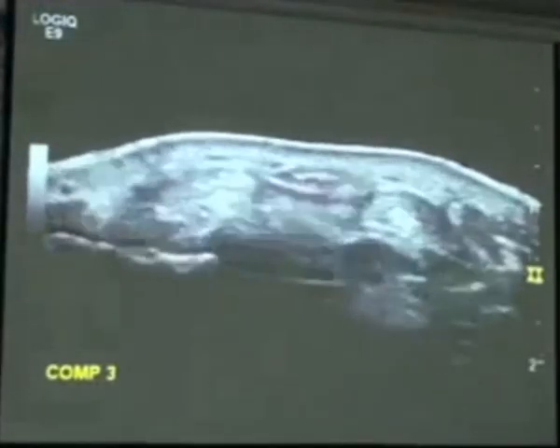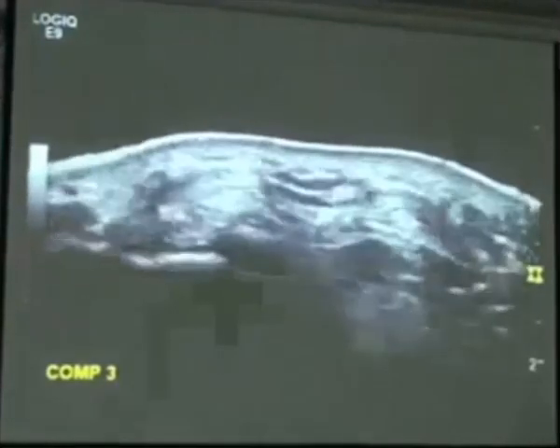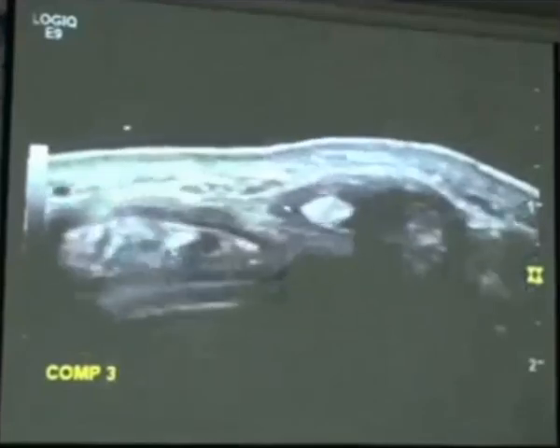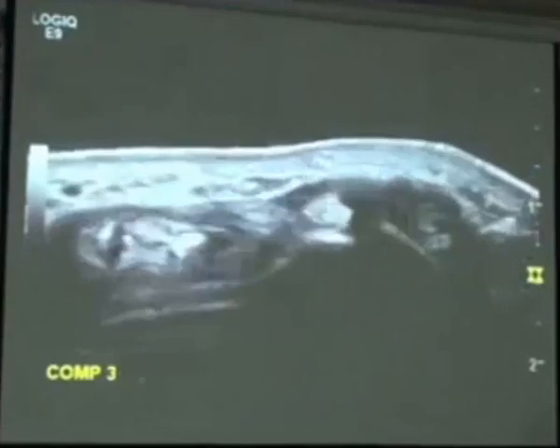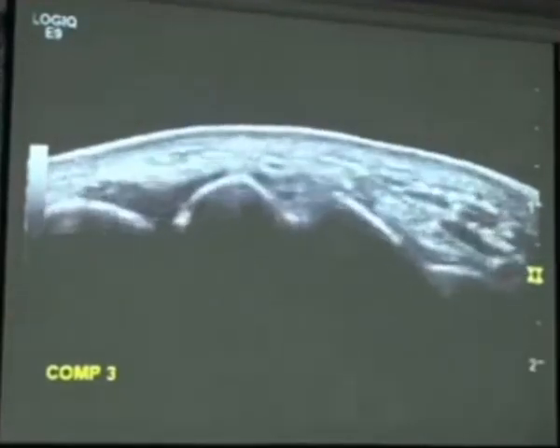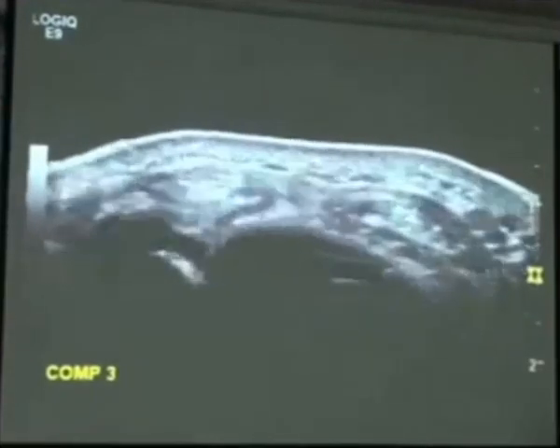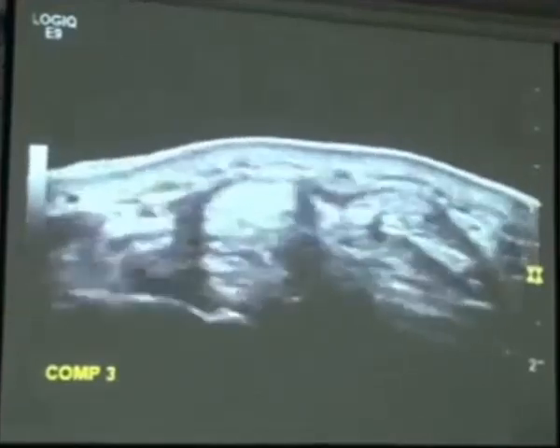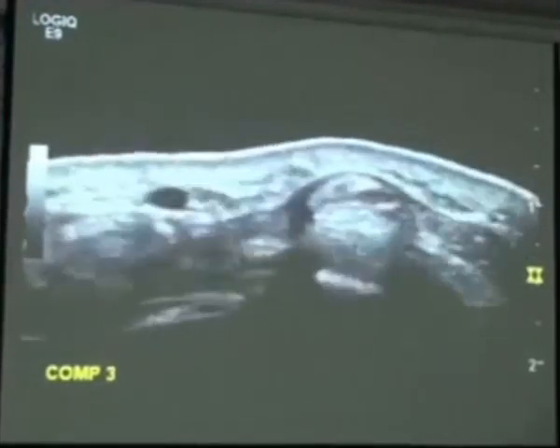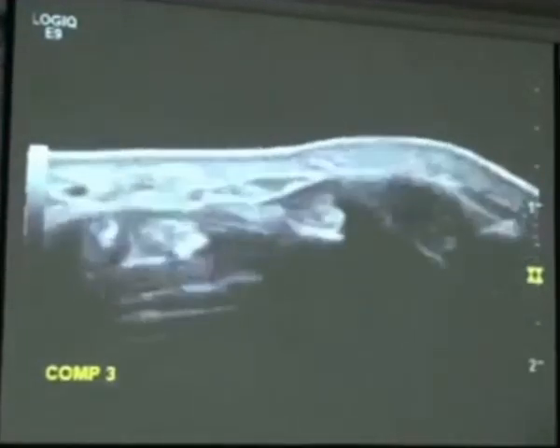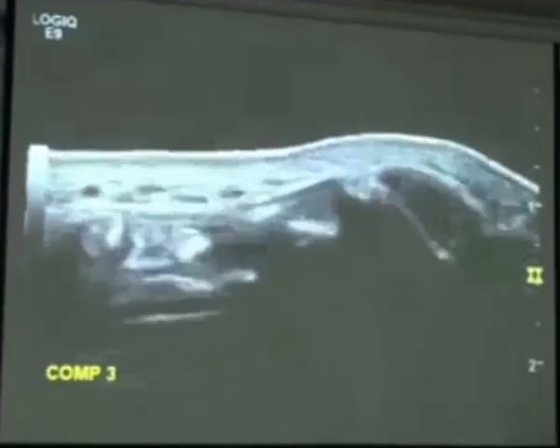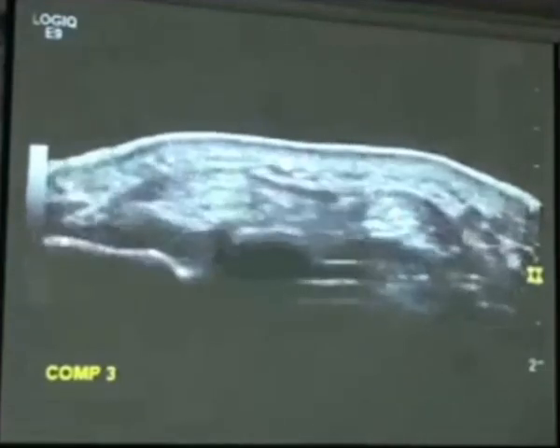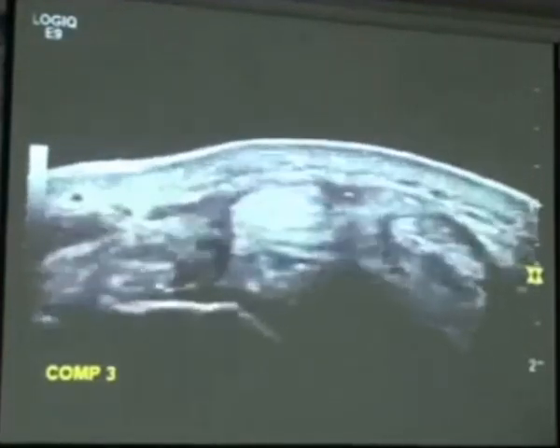Some of these tendons are much easier to see in real time, so I always use a quite smooth, steady motion when looking at tendons and following their path. The junction where the extensor pollicis longus crosses over the extensor carpi radialis longus and brevis is important because you can get a syndrome called distal intersection syndrome that occurs at that site, due to the anatomical relationship of that tendon coursing over the top of the other two.